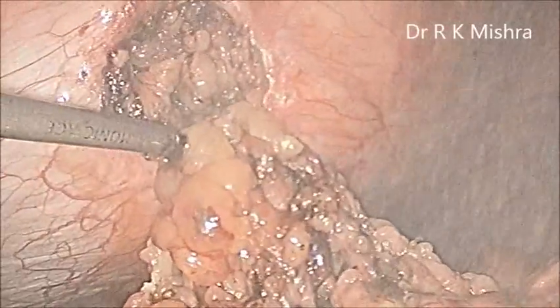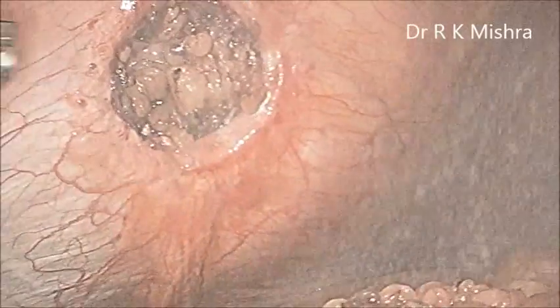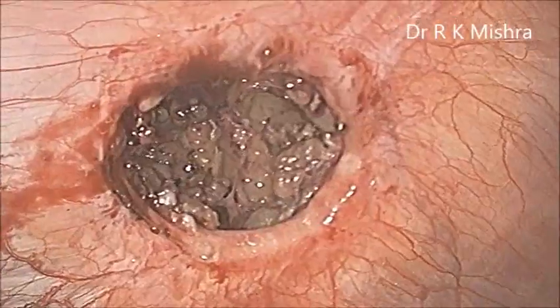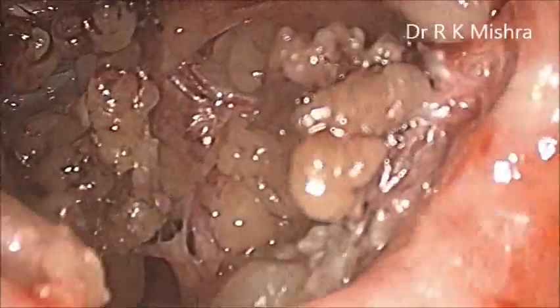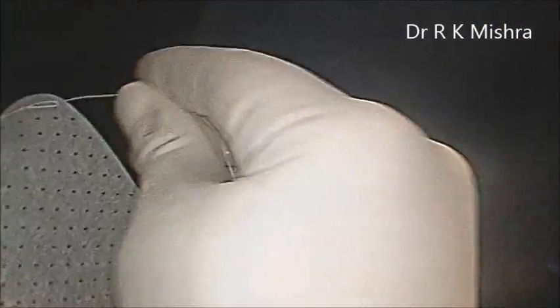The mesh we will use here is Pro Visc 160 — that is the dual-side mesh — and it has polyurethane on one side. This mesh has already pre-tied knots on four corners. I am tying one knot on each corner so that the suture should not come out. It has an already pre-tied loop, and you just have to apply the knot. The white surface we will keep towards the abdominal wall, and the blue surface we will keep towards the viscera. Now it is ready — this is the mesh ready.